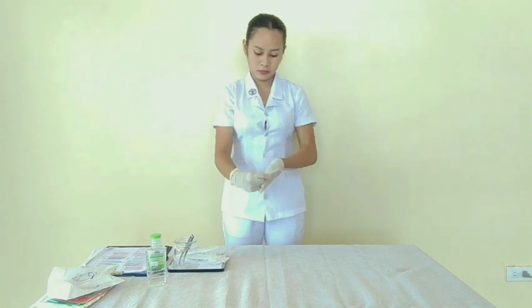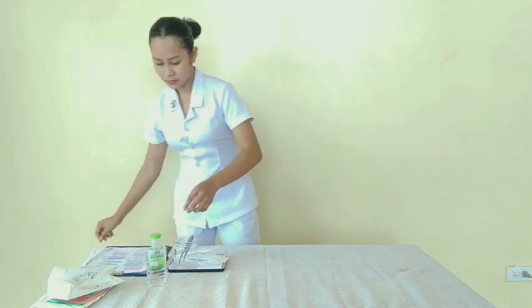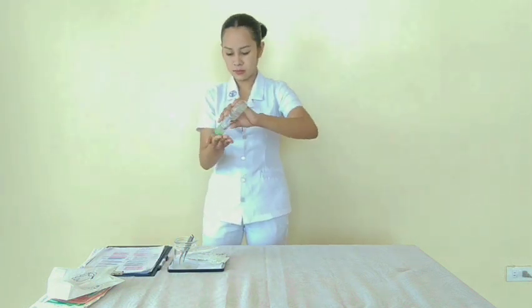Now remove and discard the gloves and perform hand hygiene. Evaluate the condition of the site in 30 minutes, depending on the test, and measure the area of redness and induration in millimeters at the largest diameter. Then document the findings of the procedure.